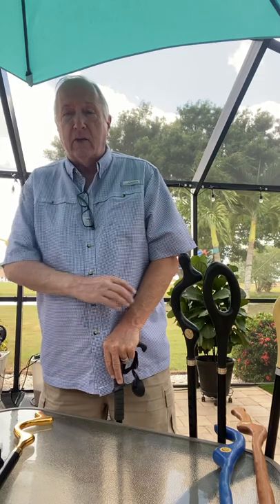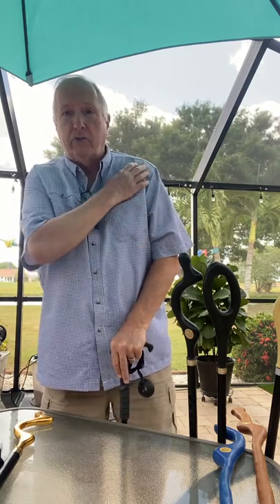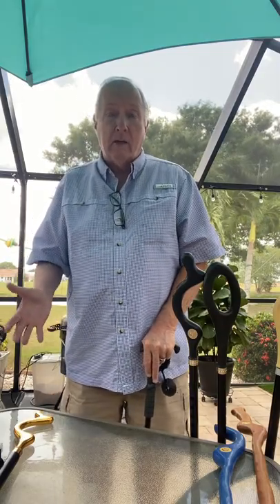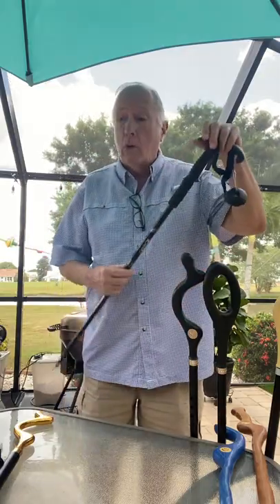Now, the purpose of a regular cane puts all the pressure on your wrist and your shoulder. You need to do that for the purpose your physical therapist and doctors say you're going to need it for. What happens then is you transition into a different situation where you're concerned more about stability.